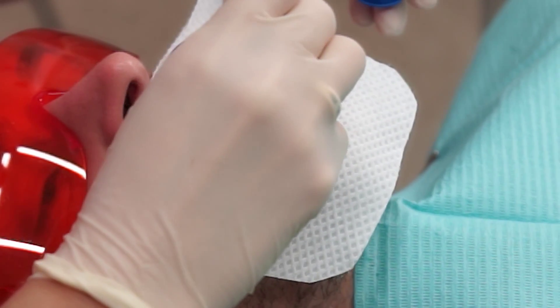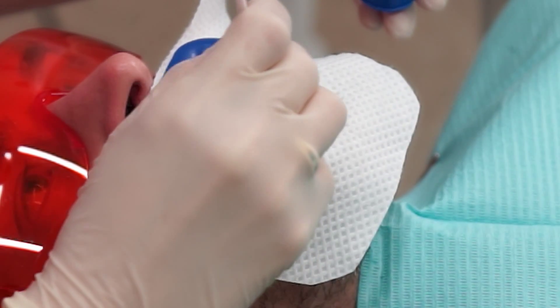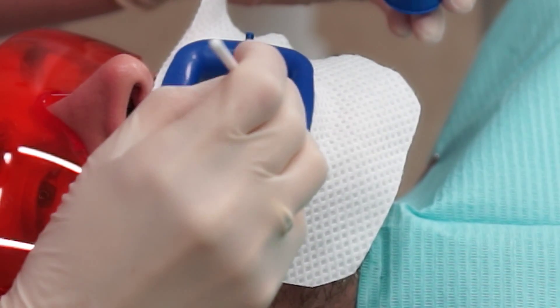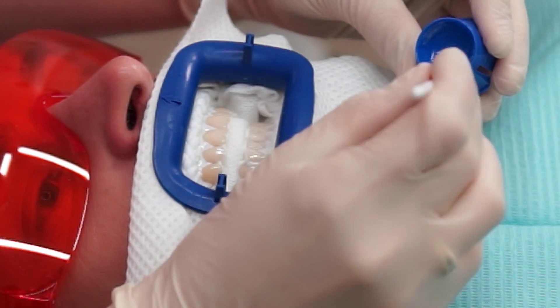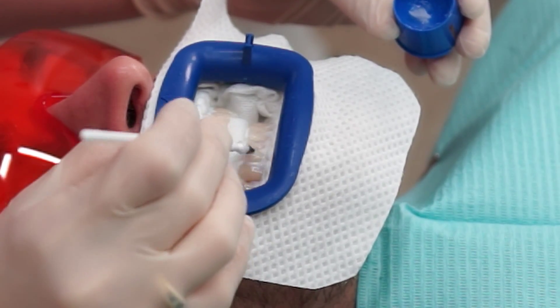The gel is applied across the buccal or outside surface of all the upper and lower teeth. The application is done carefully with a small brush. The gel itself is only about half to one millimeter thick on the outer surface of the teeth. This procedure takes a couple of minutes and all the front side of the teeth are covered well.